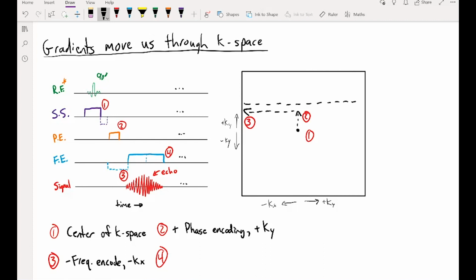And while I'm on the edges of K-space, the amount of K-space that you collect is by design. Whoever made the pulse sequence decides that. K-space itself is infinite, but the bounding box represents the amount of data we're actually collecting, because at some point the fine details on the outside of K-space aren't useful anymore, so we don't need to worry about them.